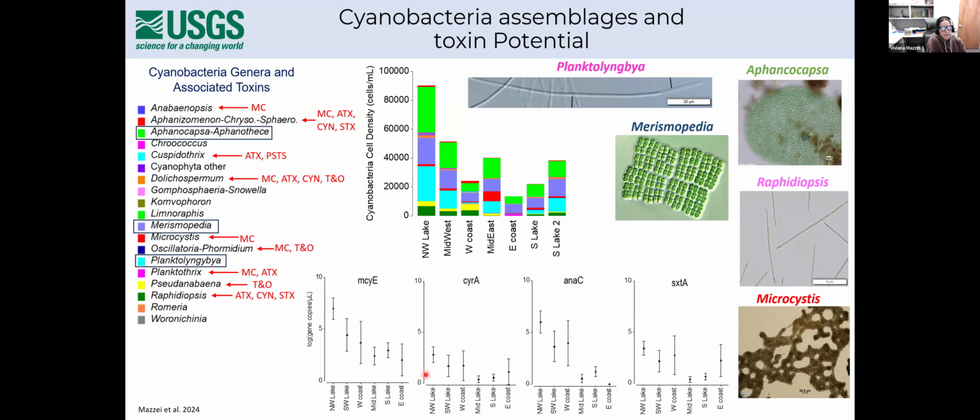lake zones. And so the information we get from biosynthesis gene concentration represents the potential for toxin production, so we know the genes are present, but we don't know if they're turned on. So we're still waiting on that ELISA data, measuring actual cyanotoxin concentrations, to tell us if the toxins encoded by these genes were also present in the samples.